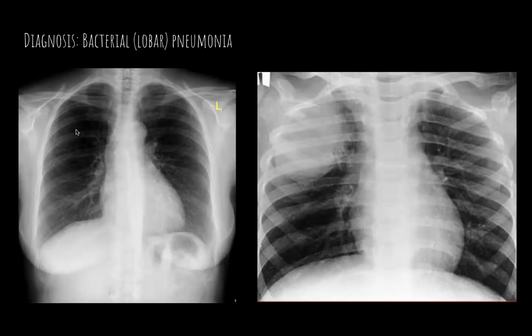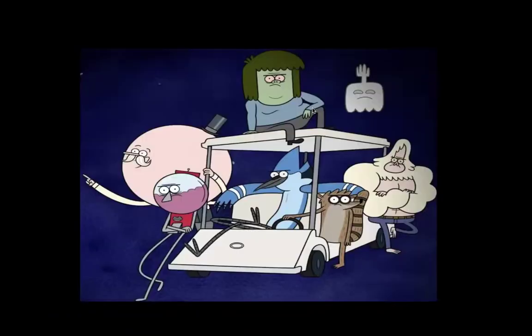So again, this is a healthy lung, and as we see, there's patent lung cavities on both sides, and there's no obvious consolidation. So Pops looks like he's in pretty rough shape, and we would want to start him on some antibiotics pretty quickly. Sounds like a plan, Josiah.